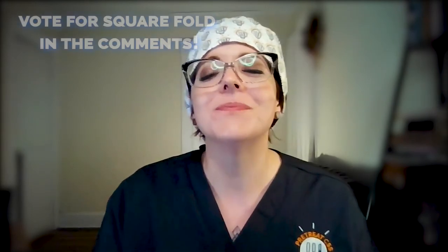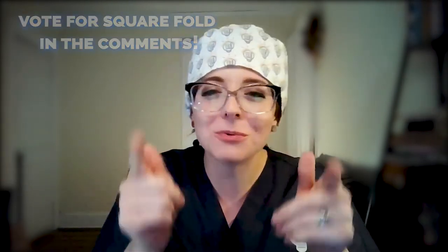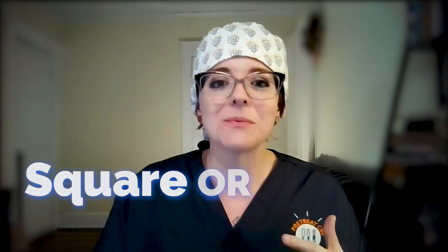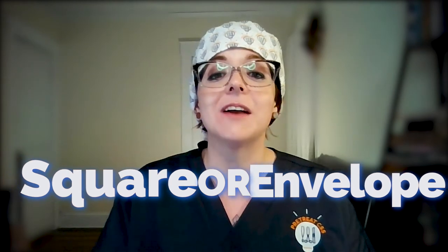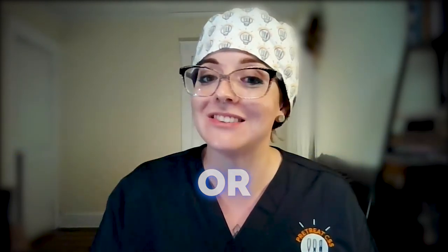Okay, square fold, I see what you bring into the sterile field, but which one do you like more? I know it's a wrap battle, but both techniques serve a purpose and are vital to the sterility of instrumentation. Envelope is a go-to technique in most facilities, while square fold is a great technique for longer, more rectangular shaped containers.